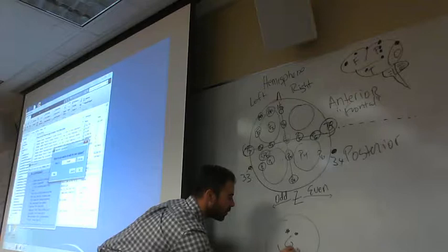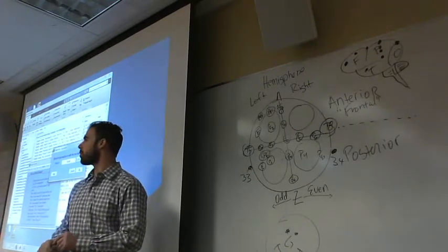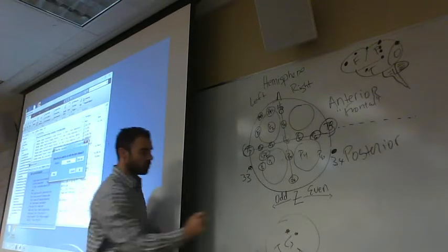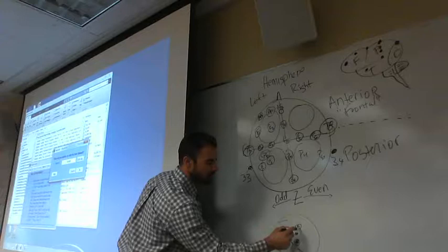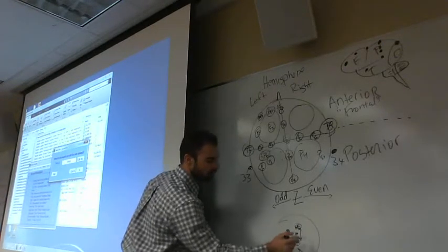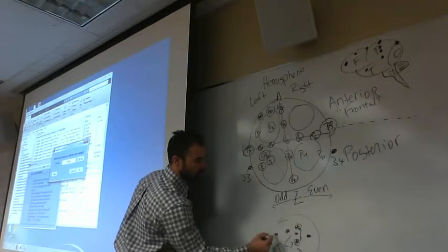If we looked at the face this way, we also talked about those ocular electrodes that we record as well. VEOG, vertical electrooculogram, would be one that is there. We also have one that is lower, under the eye. So they're going to be able to measure when those eyes blink. And we have one on the left and on the right.